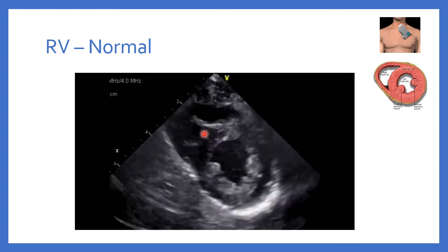right ventricle. One of the ways you know that the RV pressure is not significantly high is because the septum is bowing towards the right ventricle. And although you can't see the walls really well, you can see that they have a good amount of movement and perhaps some amount of thickening, and so it appears that the function is probably normal from this view.